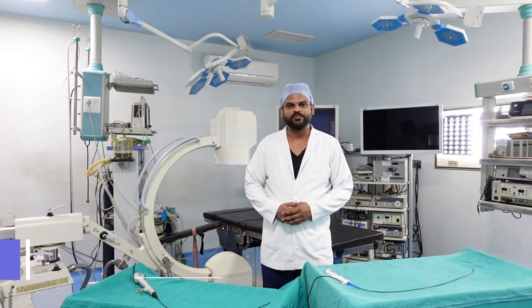Hi, I am Dr. Swapnal Singh Kushwaha, Urologist at RP Stone Cleaning. Today we are going to show you something interesting. We are going to do the first clinical and comparative evaluation of Carl Stoess Flex XC with Carl Stoess Flex XC1 in the same patient.